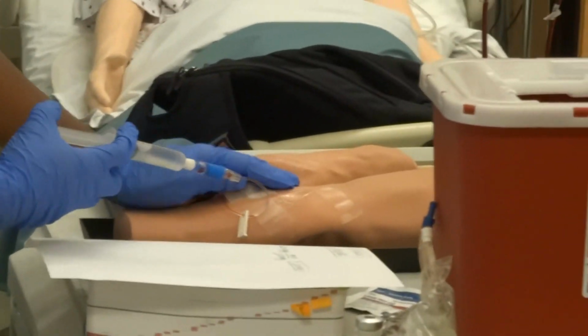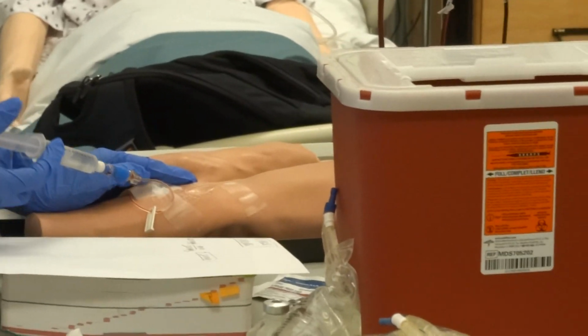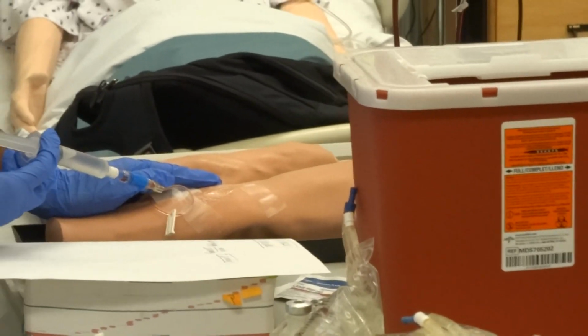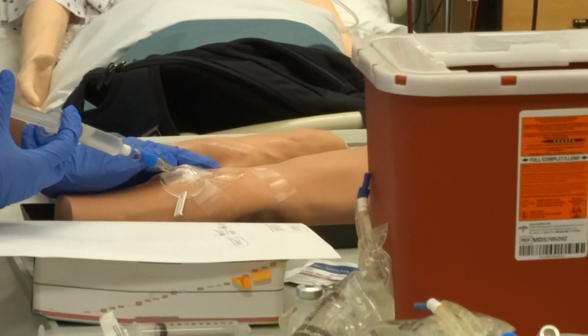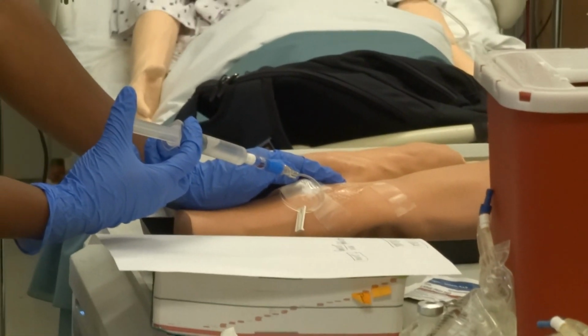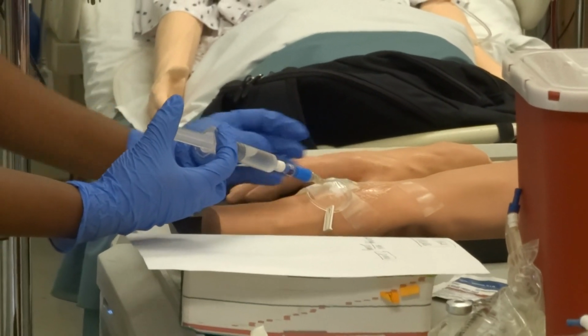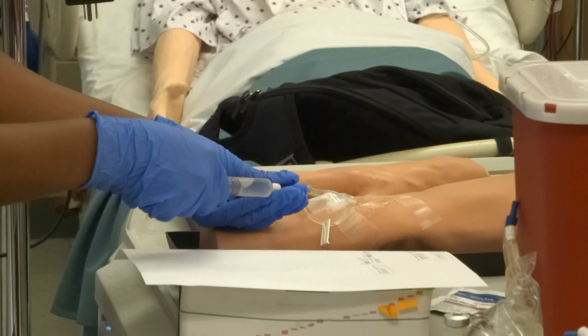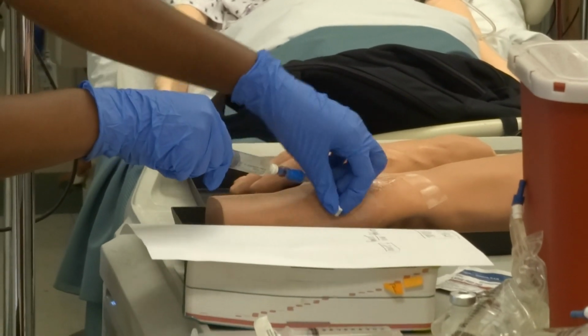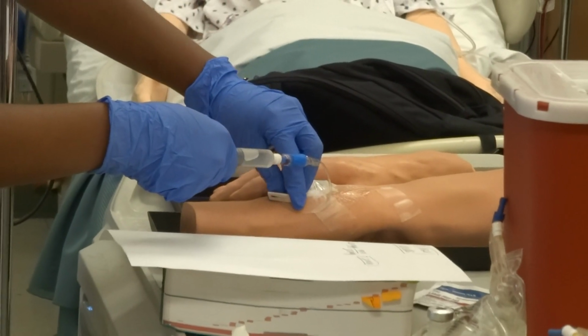So you don't really need to do that for a patient who has heart failure, but for purposes of competency, I would push all the way to 5 just to check it. And meanwhile, I'm touching it and seeing if there's any swelling, any redness. No, I don't see that. I'm not really going to go all the way to 5, but you guys get the idea. And then go ahead and knock this back meanwhile.